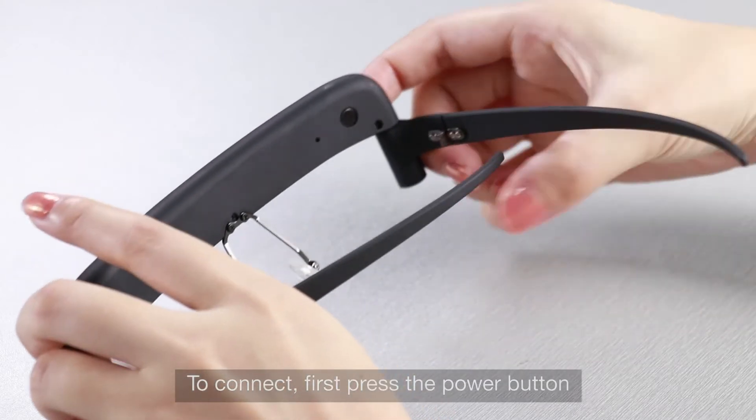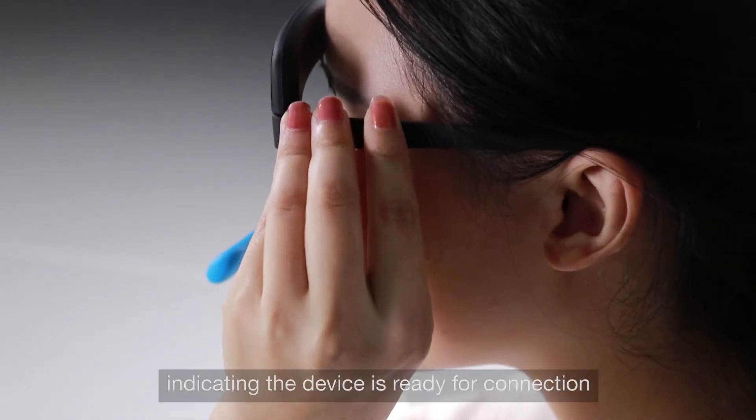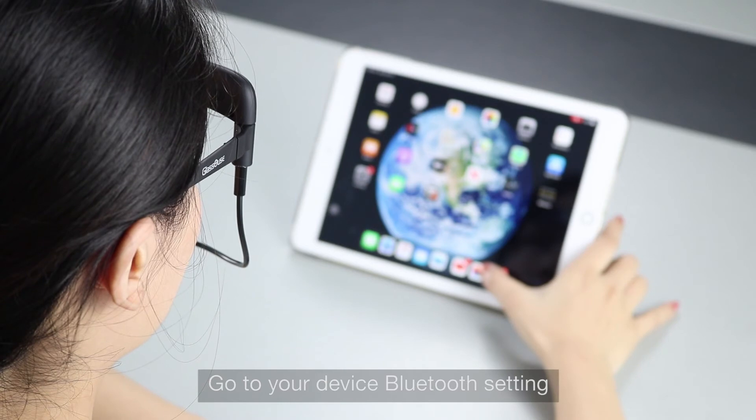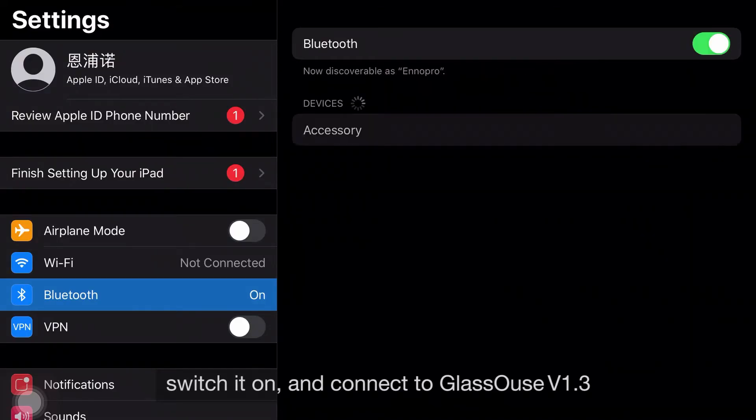To connect, first press the power button. The blue LED on the front will start blinking, indicating the device is ready for connection. Go to your device's Bluetooth settings, switch it on, and connect to GlassOuse V1.3.